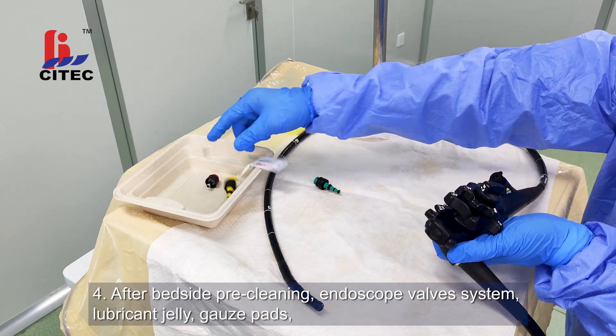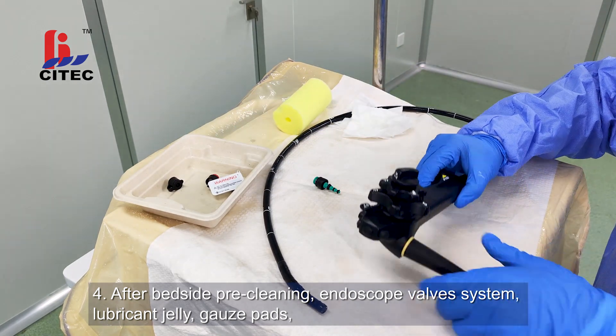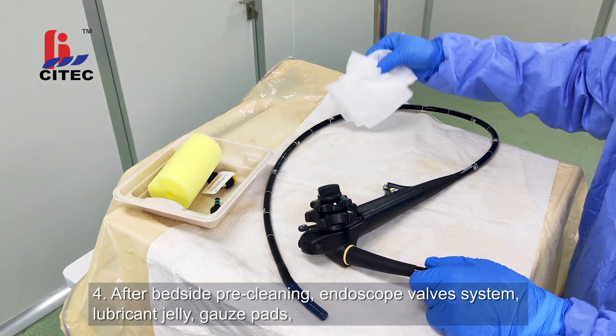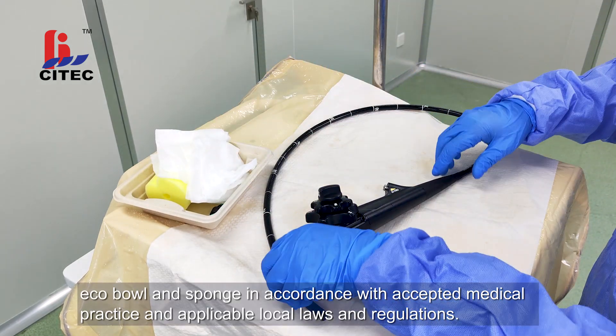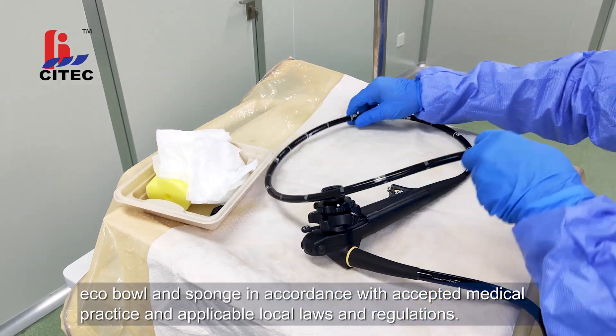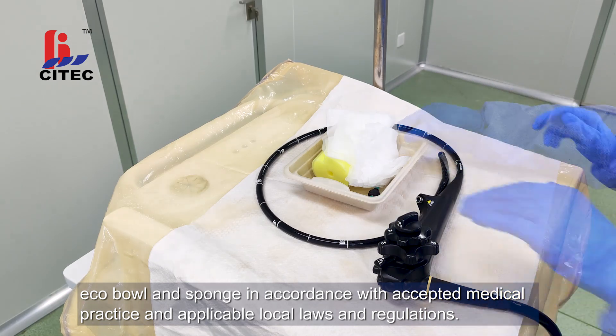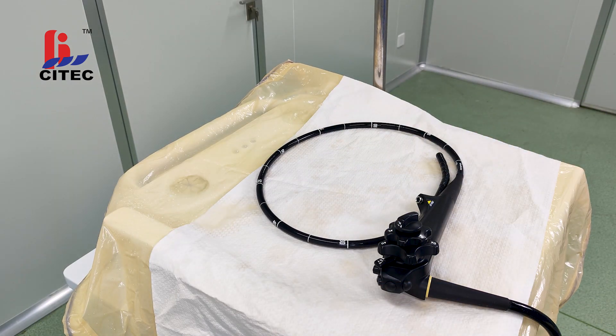After bedside pre-cleaning, dispose of the endoscope valve system, lubricant jelly, gauze pads, eco-bowl and sponge in accordance with accepted medical practice and applicable local laws and regulations.